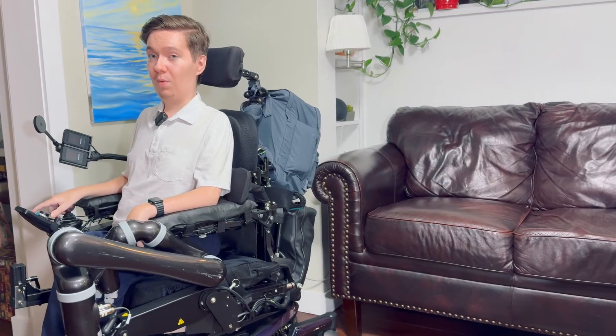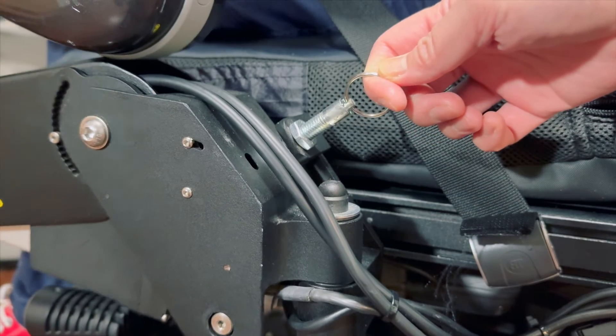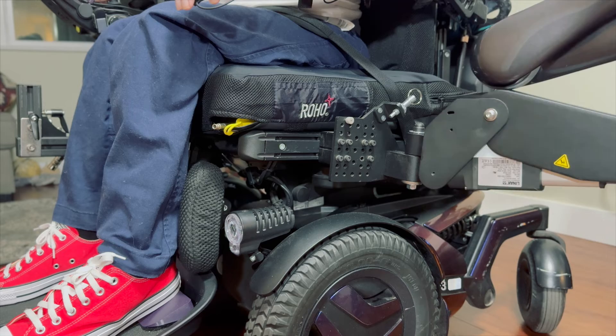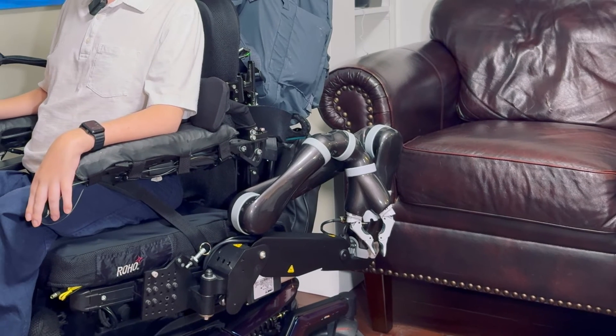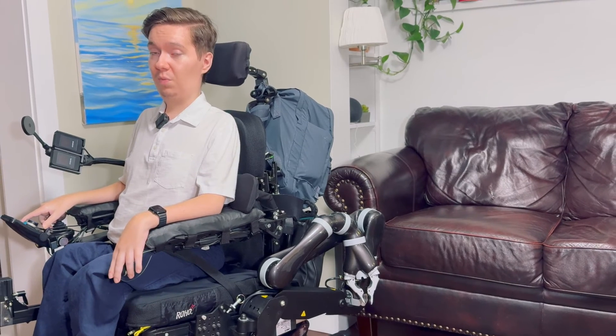The last feature of the lift arm I want to tell you about is the swing-away feature. With the lift arm swung all the way out, we now have unimpeded access to me in the chair, enabling much easier transfers in and out of the wheelchair.